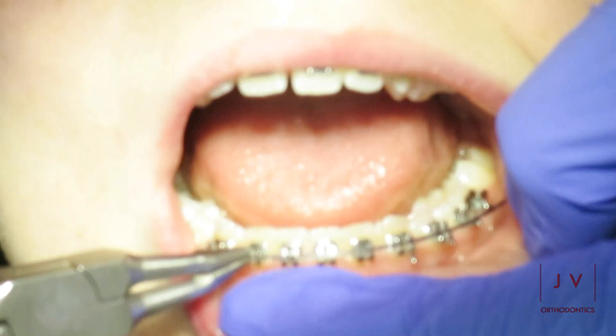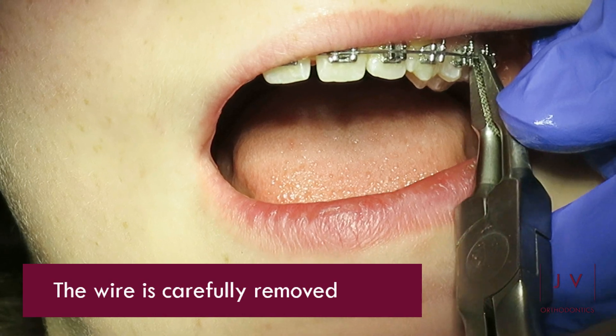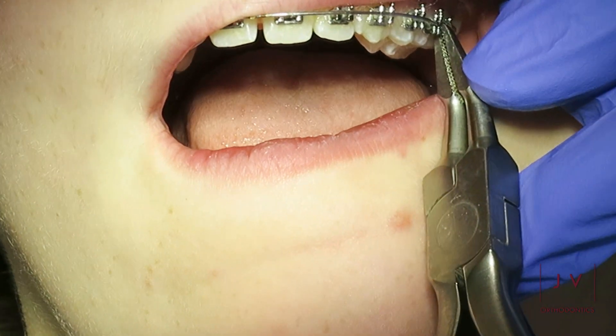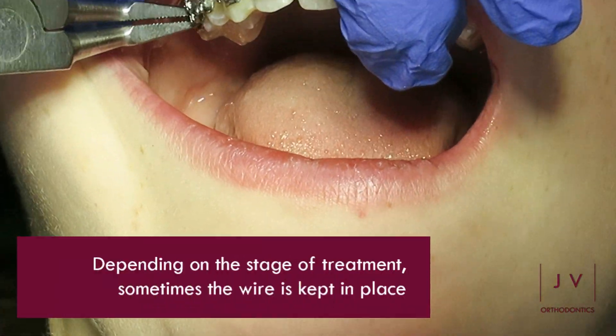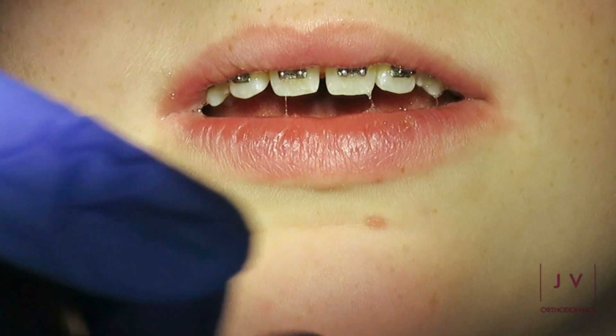Removing these elastics then allows us to carefully remove the wires from the brackets on the brace. Depending on the stage of treatment, we will sometimes keep the wire in place if we feel that it can do more for us and move the teeth more into the positions that we want them to be in.